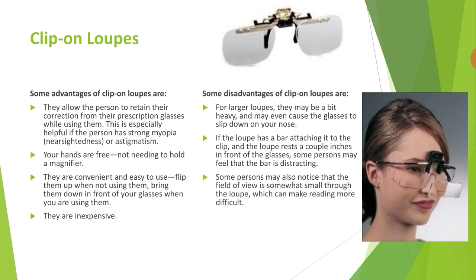Flip them up when not using them, and bring them down in front of your glasses when you are using them. They are inexpensive. Again, anyone can buy this because it is not expensive. They were made without giving high prices for low vision patients. Okay.